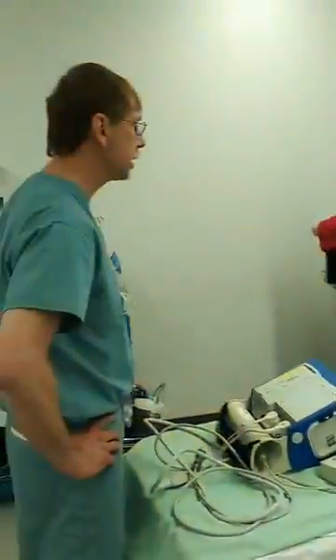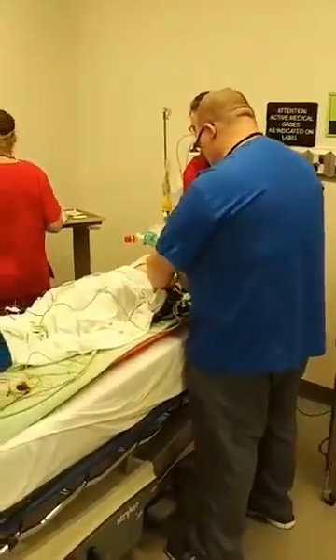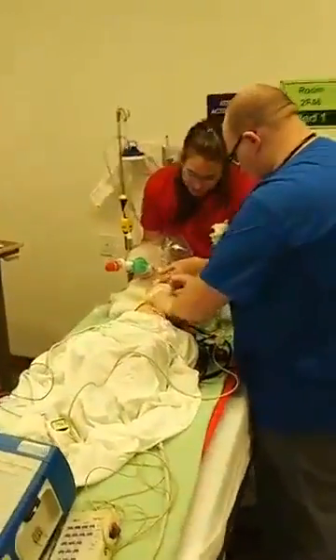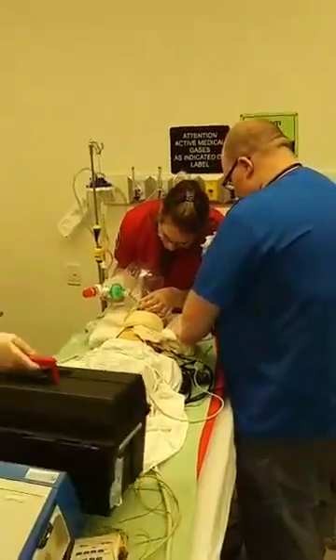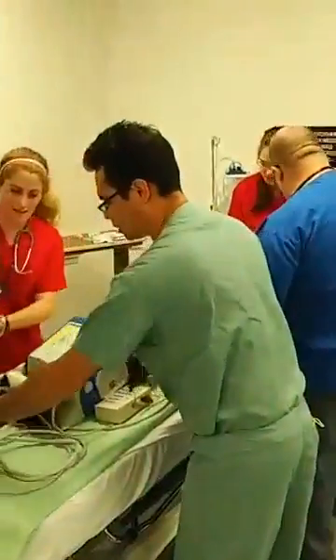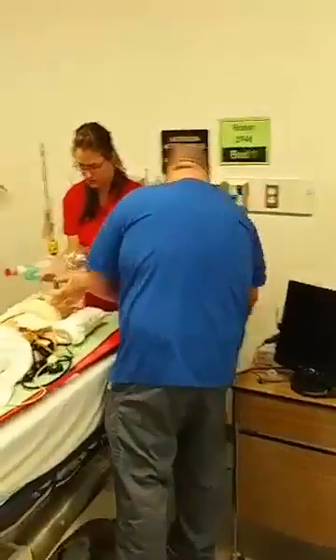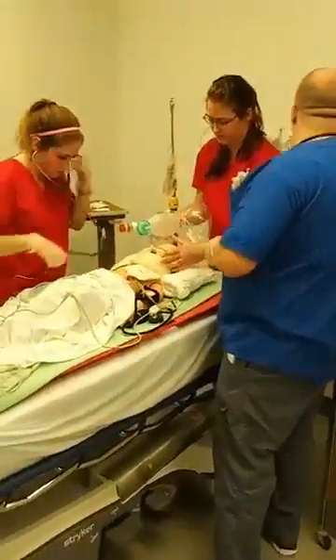So what do you want to reassess? So, pulse, blood pressure, circulation. How's the airway? Is it secure? It is secure, yeah. Moving that chest still? Yep. Okay. Did you listen to the chest? We'll put this behind here, yeah. Okay, have a listen to the chest, make sure that tube doesn't move before we go.